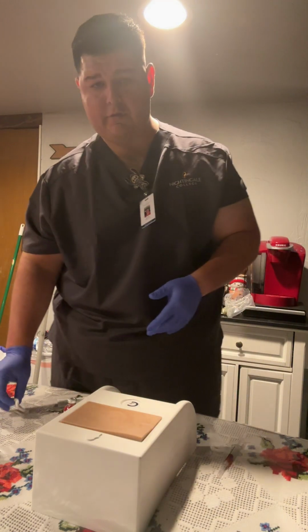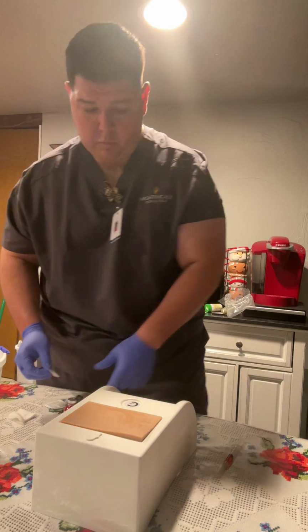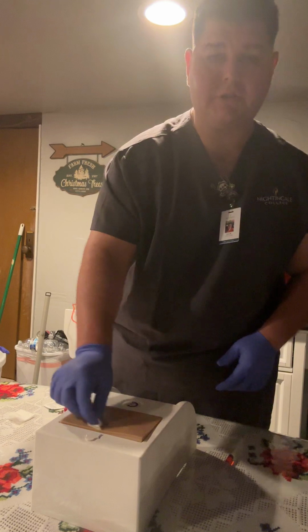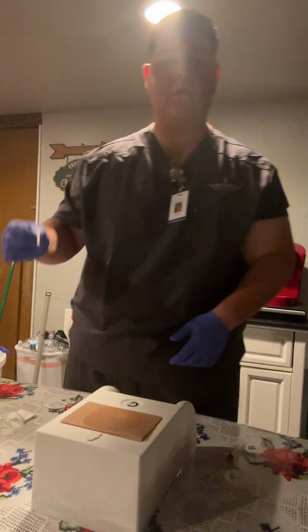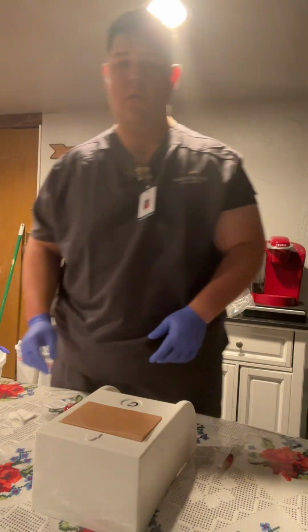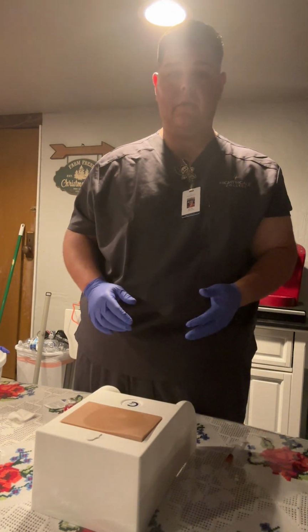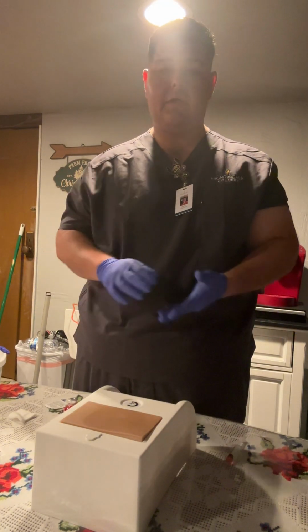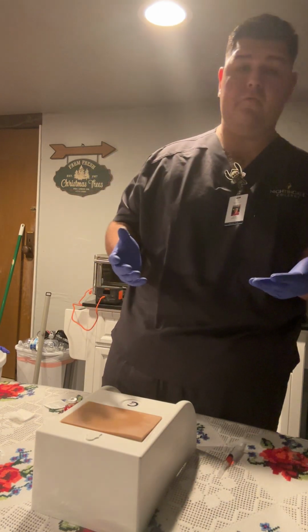I will then take my gauze, or pardon, my alcohol pad. I will clean the site in a circular motion from the middle to the outward, 2 inches. I will dispose of the alcohol pad. Once I clean my site and it's ready to use, I want to let it air dry. I don't want to touch it, so I'll give it a few seconds. Now that it is dry, I can move on to the medication.